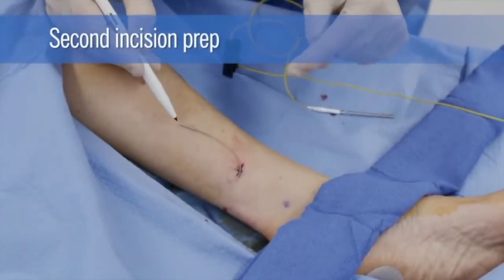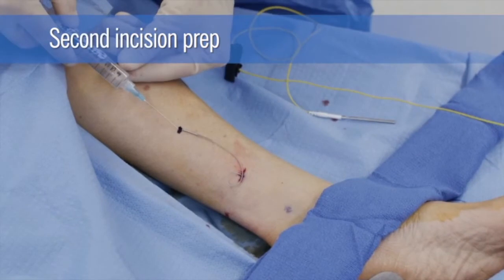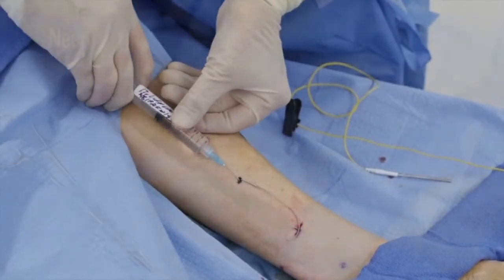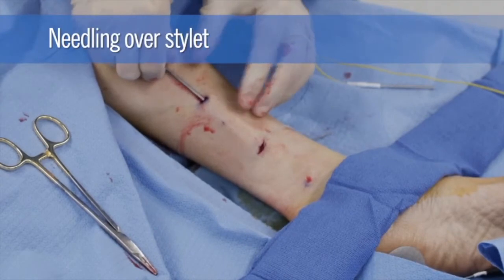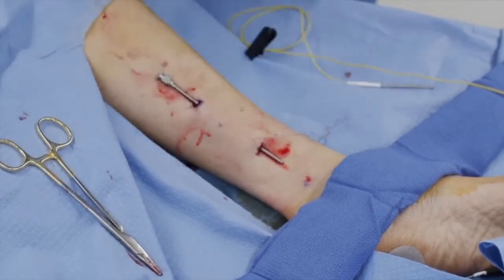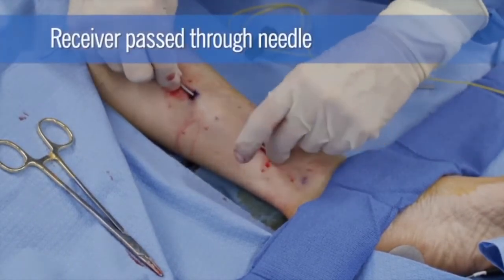Following additional injection of lidocaine along the planned trajectory of the lead, a second incision is made superior to the first incision, and the excess wire is tunneled under the skin through this incision. The needle is placed over the stylet and advanced from the proximal to distal incisions. The stylet is removed and the lead receiver is advanced from distal to proximal incision through the needle.